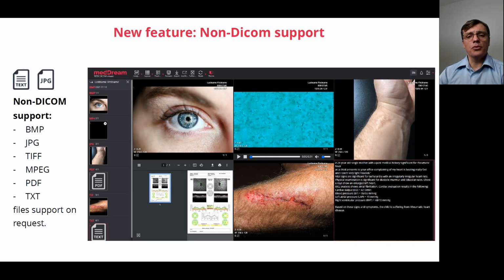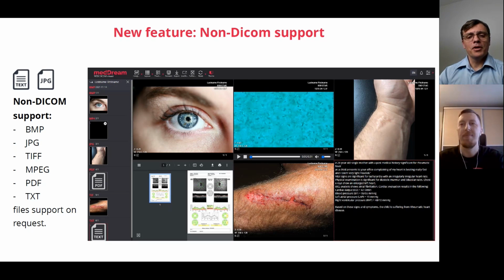So now I'm proud to give the window to my partner and good friend, Marius, who will show you how the file system plugin works. I would also like to say that he also did some technical trainings, which you can find on YouTube, on how to work with this, and it was already officially released with technical training. So I really recommend, if you are in need of non-DICOM support, please also watch his technical trainings. So please, Marius, proceed to show the window.